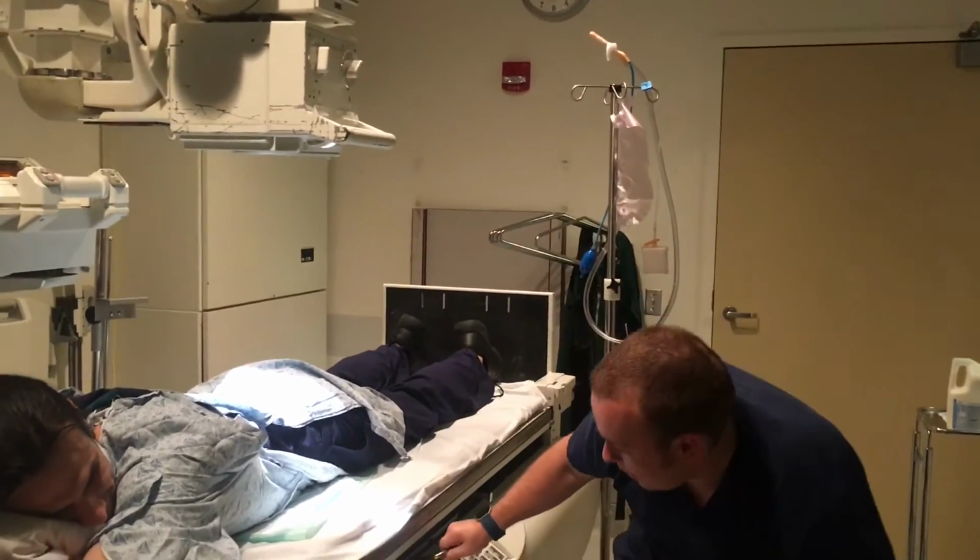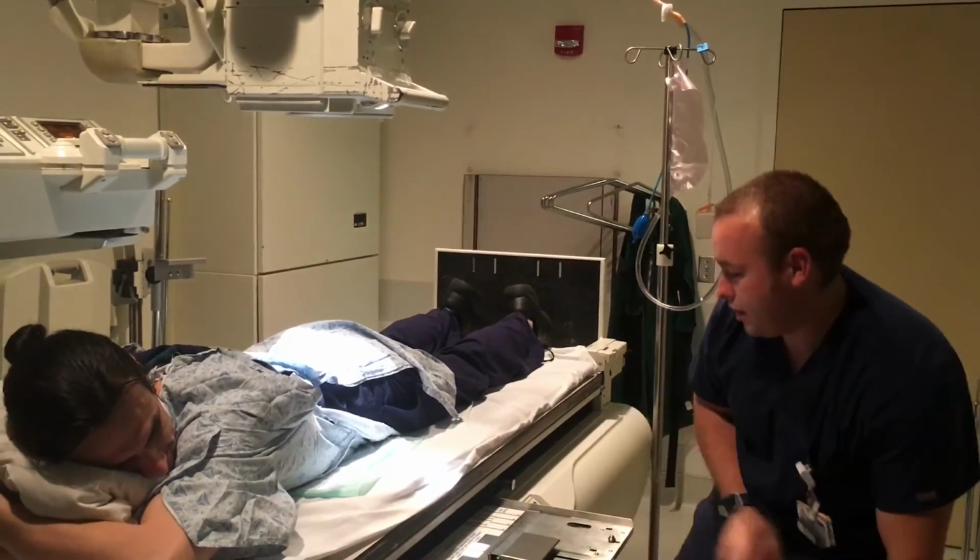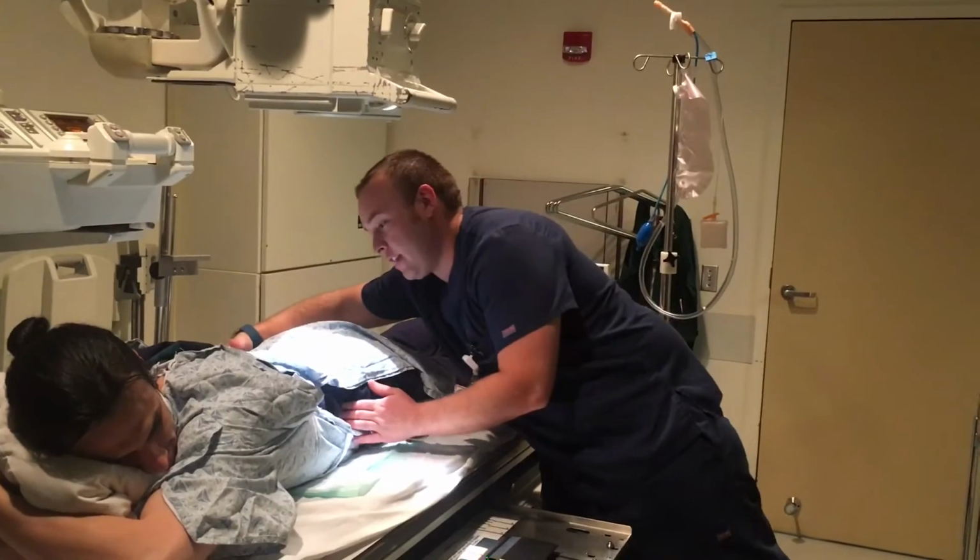Alright. So again, we want to make sure that we're mid-sagittal at iliac crest.